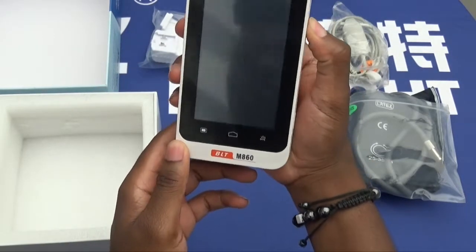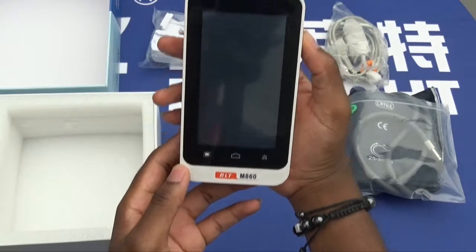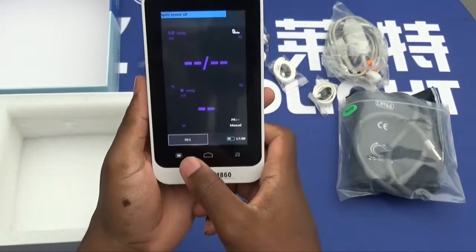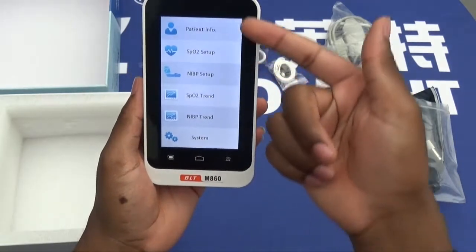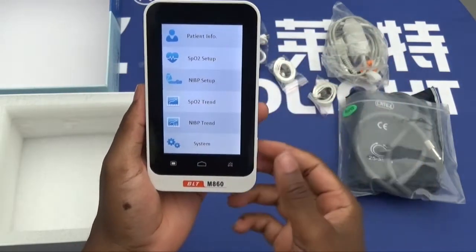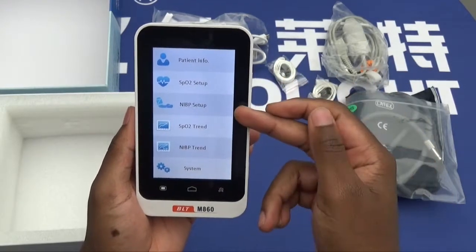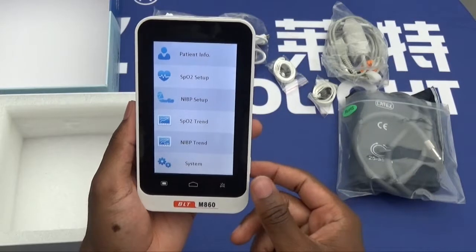Turning on the device includes just pressing the on-off button for one second and you're greeted with the menu. Pressing the menu button allows you to access all the various steps that you may need, such as the SpO2 setup, NIBP setup, and also the trend data you may need.